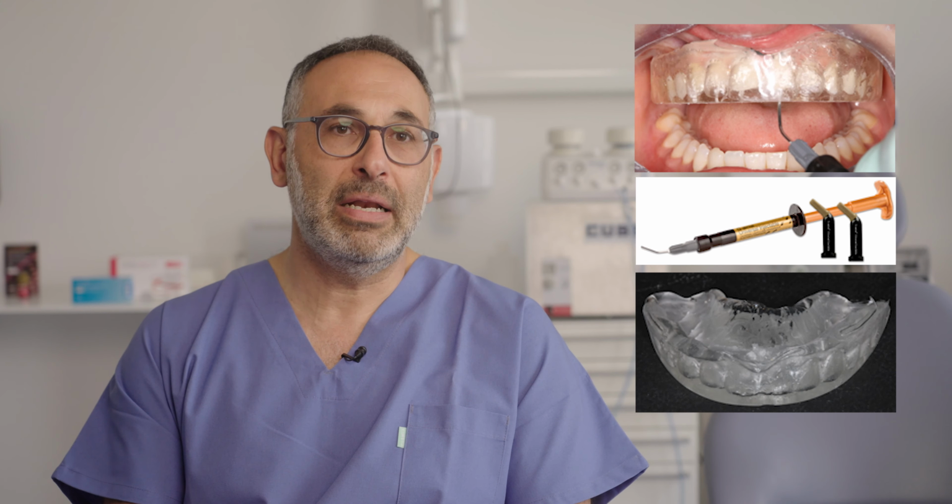What product to use to do a mock-up? In fact, it depends on what your support is. If you are using a transparent vacuum tray, then you can use any flowable composite. It is preferable that it's a highly filled composite, like for instance a Gillian universal injectable or any other material that is filled above 65% by weight of fillers, so the light cure can penetrate through the vacuum tray.